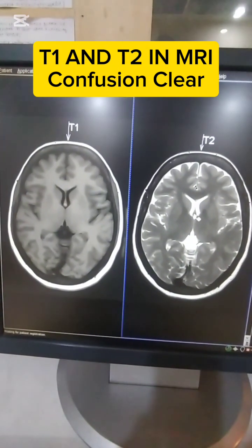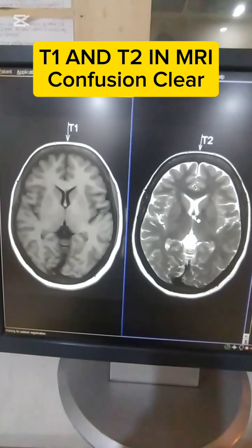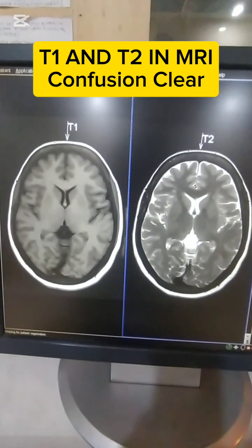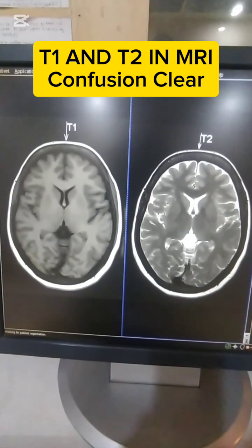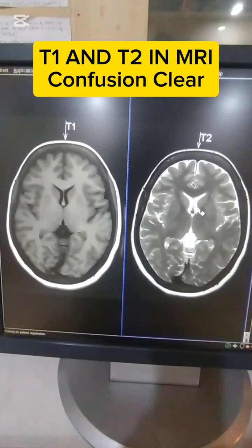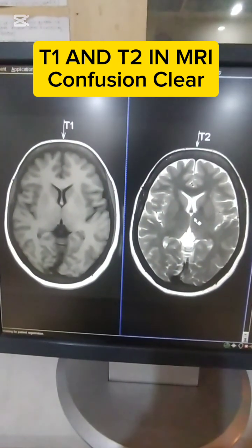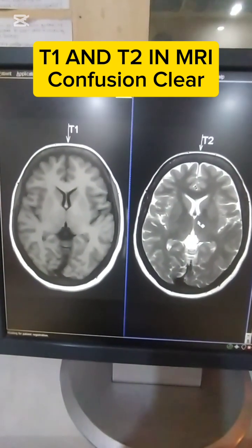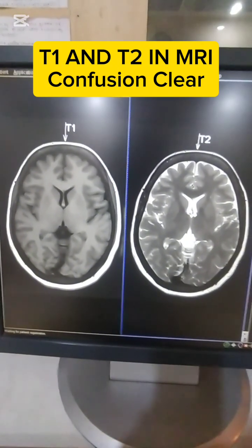And in the T2 sequence, the TR, or repetition time, and the TE, or echo time, are long. If we want the CSF bright, we have to wait a long time to receive the signal, and then we get this T2 image.